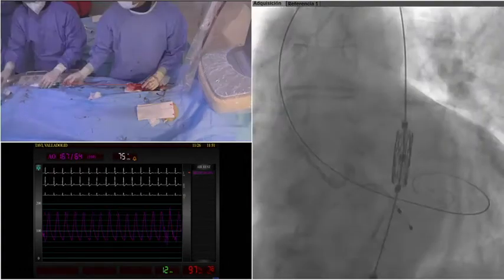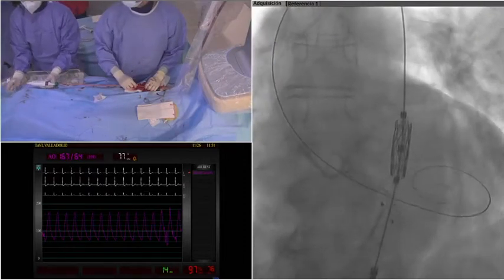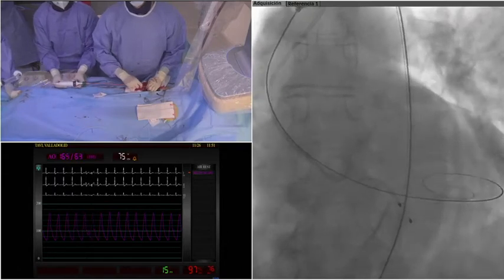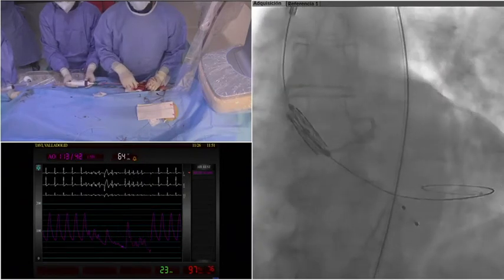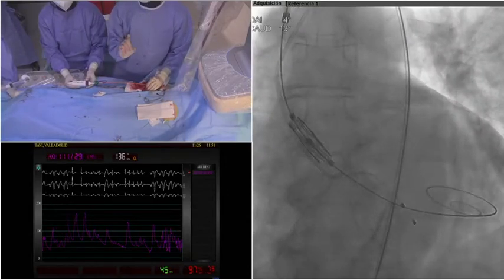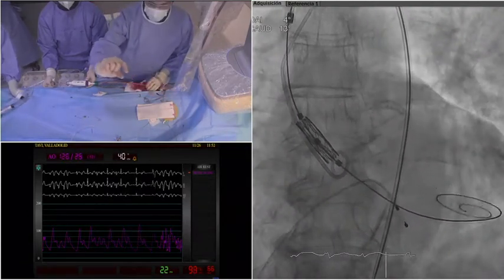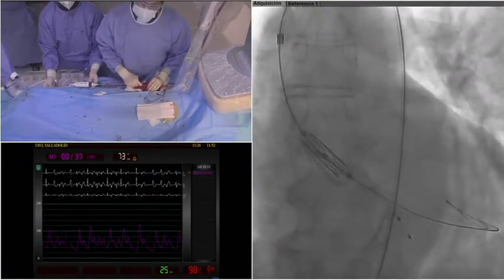Belén, whenever you want. The screen. So we start doing the flex, and I continue advancing. You hold the guide. While Hipólito is doing the flex, we advance. Okay, I'm going to place the prosthesis properly before advancing anymore. So I'm going to do cine here just to see the radiopaque bands. Okay, so on the ventricular side there is a more dense band, then a more clear one, and there are more dense ones. We go to this second one.